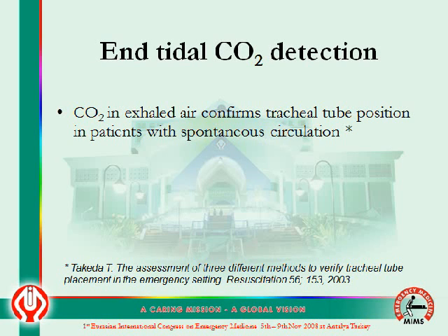As far as end-tidal carbon dioxide detection is concerned, carbon dioxide in exhaled air confirms the tracheal tube position in patients with spontaneous circulation.